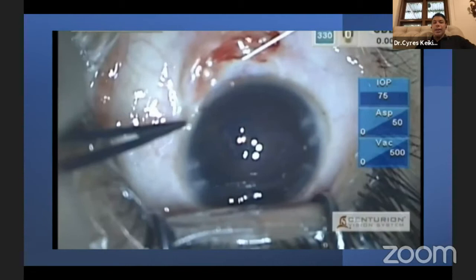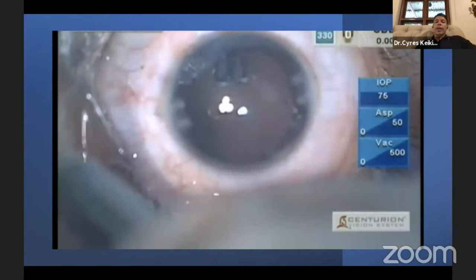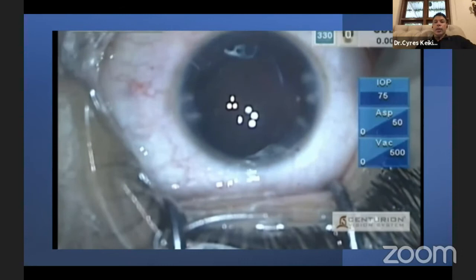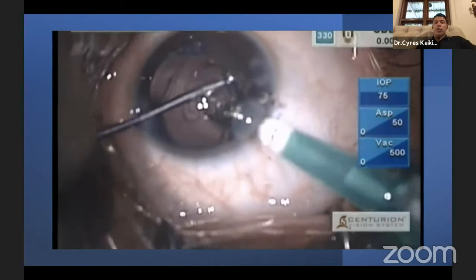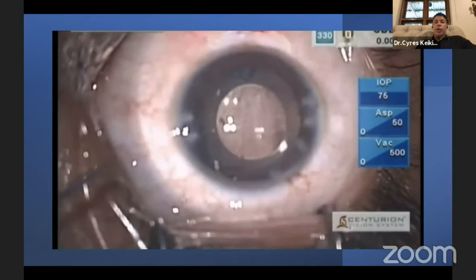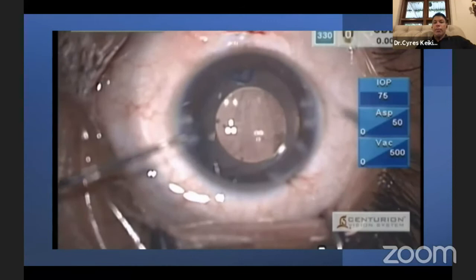We imbricate the anchor inside the capsule, then pass through the sclera twice. I don't make flaps — I just bury the knot in the tunnel made by the needle, which is sufficient because Prolene is a surprisingly strong suture and the knot is tiny. When injecting the IOL, do it very gingerly and slowly on a repositor so that when it springs open into the capsular bag it doesn't tear the bag or dislodge the anchor. We now have a perfect situation: anchor in place and capsule supported.